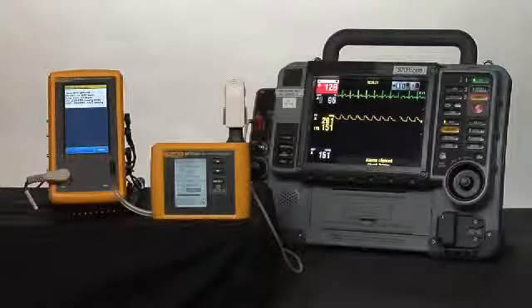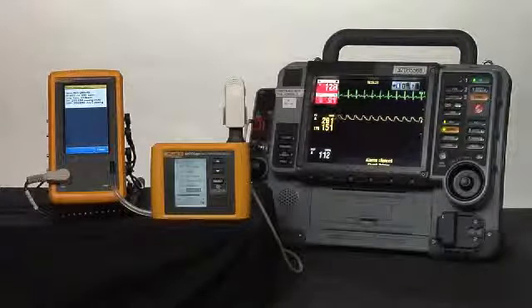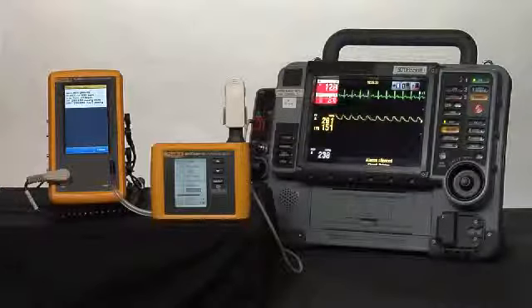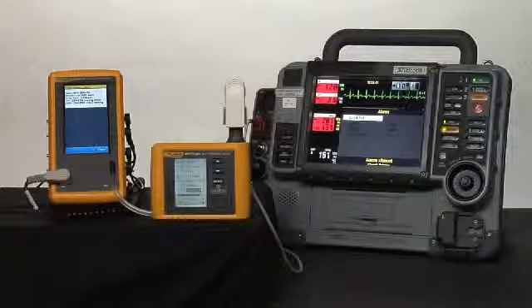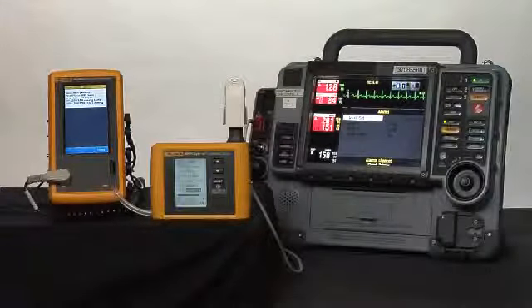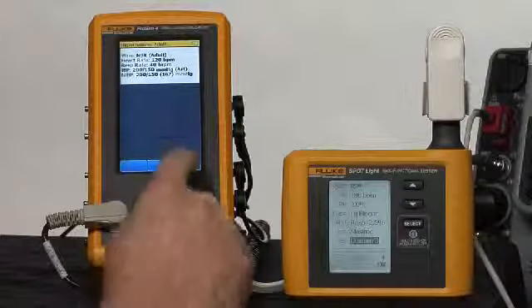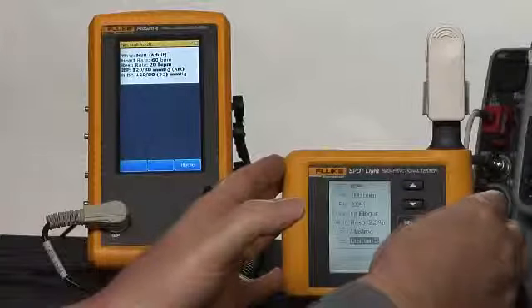You'll hear the music begin from ProSim 4 as it simulates the NIBP from the patient. We'll make the measurement. Because this is a hypertensive patient, it sets off the high limit alarms. That's normal. We can silence those while we're waiting for the rest of the values to settle in and the NIBP reading to finish. And there we go. We will now go back to ProSim 4 to a normal patient.